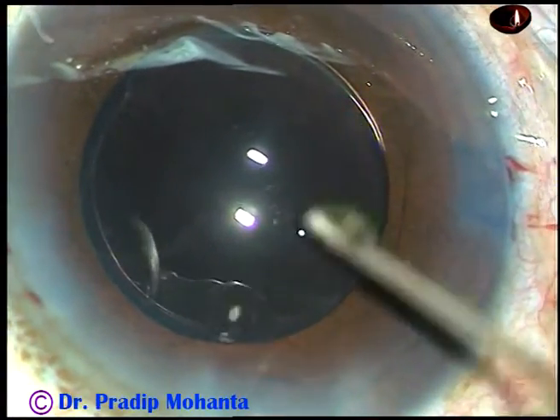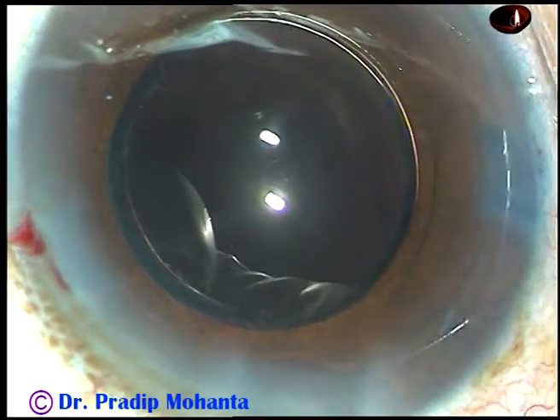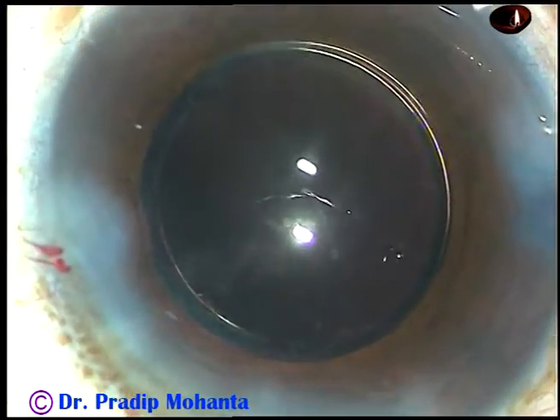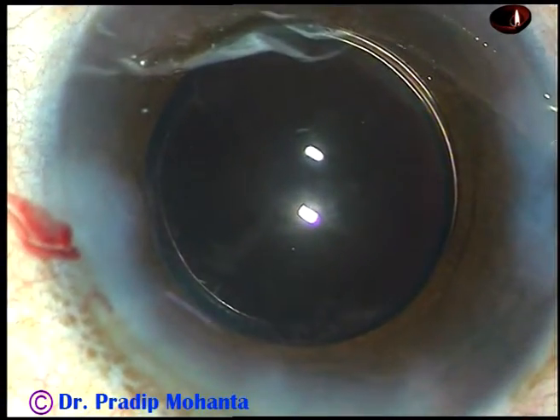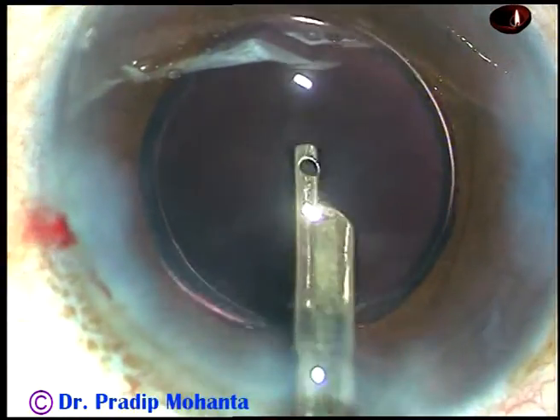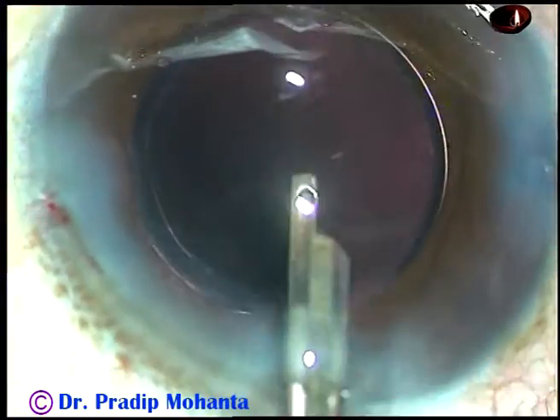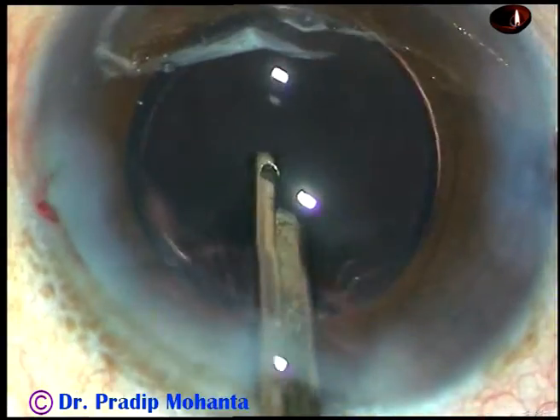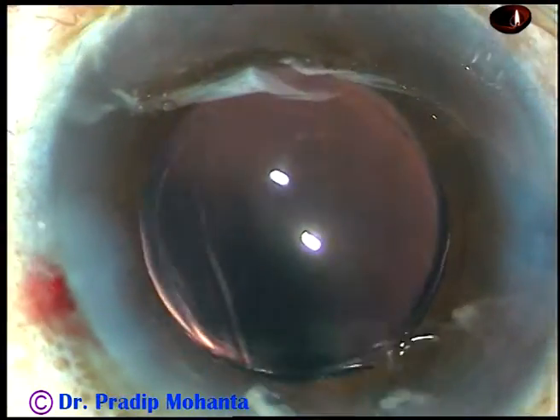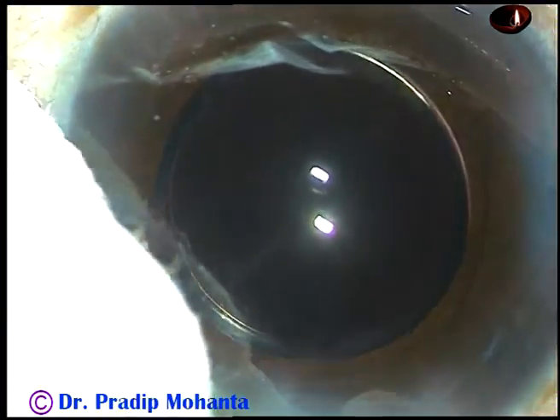And now a little bit of moxifloxacin is injected. Now the side ports are closed by stromal hydration — the corneal stroma on either side of these stab wounds is hydrated and the lips of these stab wounds oppose. This is the final lavage of the anterior chamber. I go behind the IOL and irrigate the capsular bag, and thorough cleaning of viscoelastic substance is done. The capsulorhexis has been very nice — you can see the rhexis is overlapping the rim of the optic all around. The wounds are checked and the case is concluded.